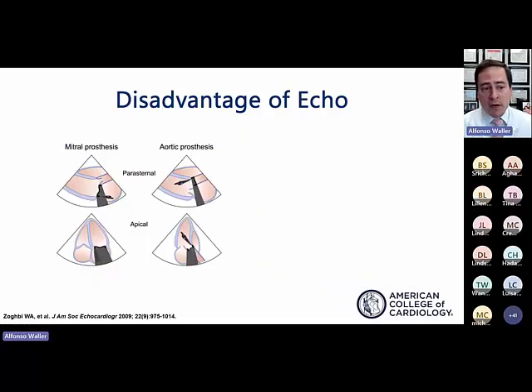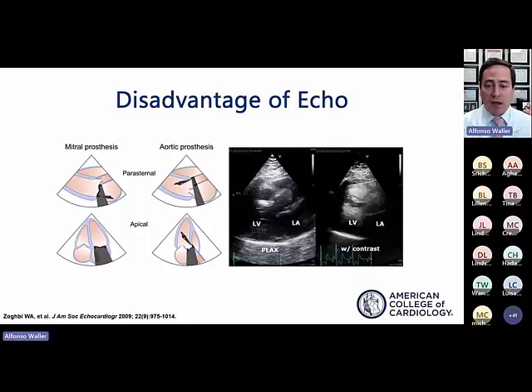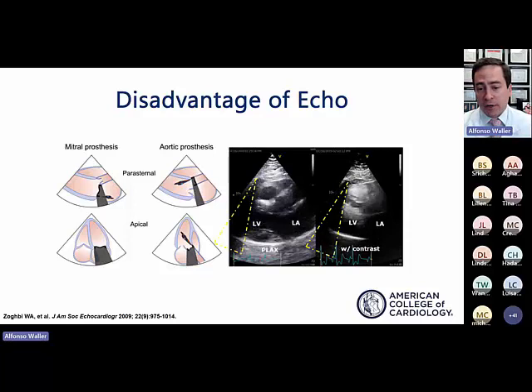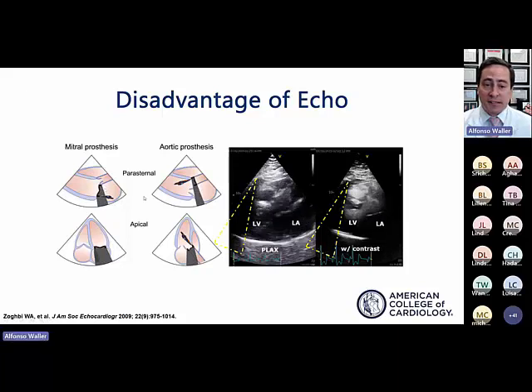Other disadvantages of echo include acoustic shadowing. So depending on where you're imaging from, you may get acoustic shadowing. This is an example of a parasternal long axis in a patient who actually has a loop recorder. So there was acoustic shadowing from the actual loop device, which would obviously impact the interpretation of what's going on in the left ventricle. Even with the aid of contrast, those segments would not be visible. So unfortunately, a lot of metal can impact assessing cardiac structure.